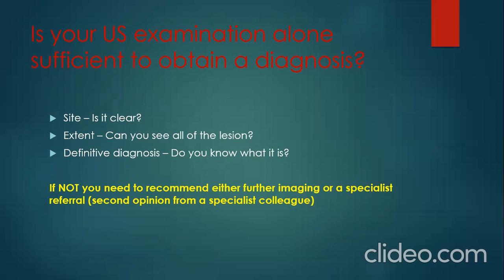You need to appreciate the limitation of the machine that you're using, because remember, these ultrasound machines have different contrast and different quality when dealing with superficial lesions. So you need to know the limitations of your machine. And the third thing, you need to know the limitation of sonography, ultrasound as a modality. As we mentioned earlier, it's not a superhero. In some cases, it is limited. So you need to know all these three limitations.